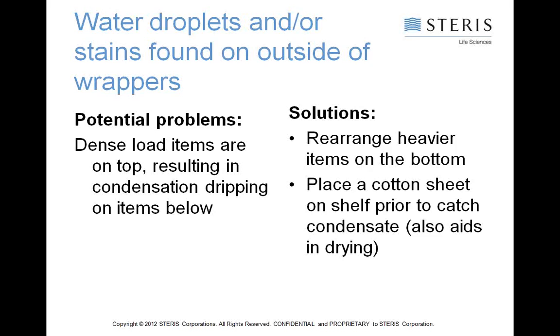And the other thing someone said, and I've never tried this, but you'd place a cotton sheet on the shelf prior. If you can't avoid that, if the whole load is dense, a cotton sheet to catch some of that may help. And it's still going to allow air to be pulled through the cotton, so you're not going to trap air in that way.